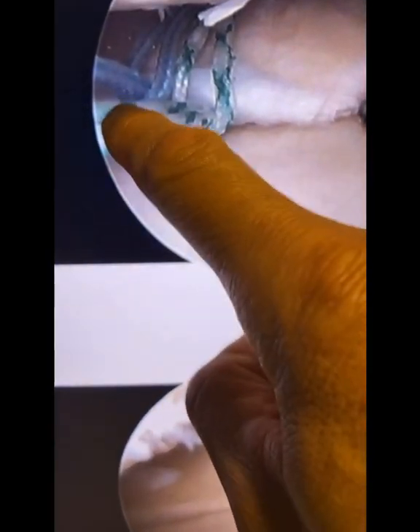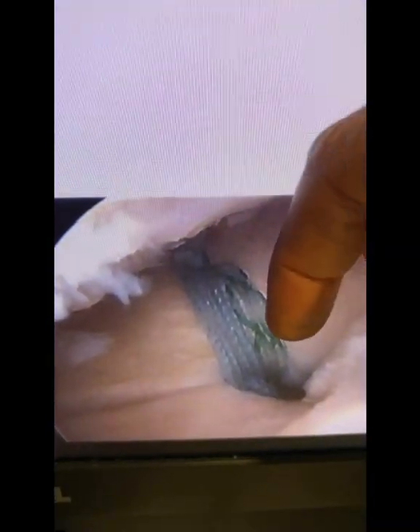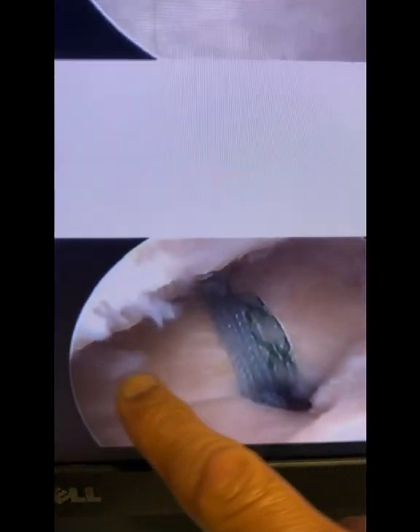The sutures are then passed — four suture limbs passed into this intraosseous tunnel. You can see the gap that was present. Well, that gap is no longer present because the meniscus posterior horn is now being reattached back to bone. These four suture limbs are pulled on, compressing the posterior horn up against a bleeding bone. Over time, a natural spot weld will occur, reattaching the root back to the bone so that when downward pressure occurs, the meniscus will cushion rather than be pulled or pushed away.